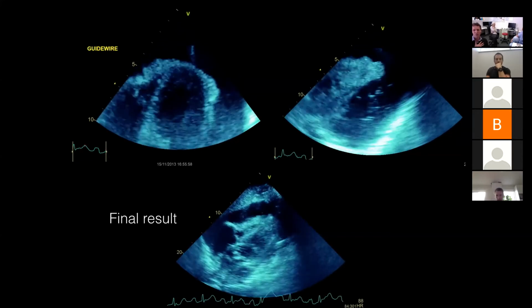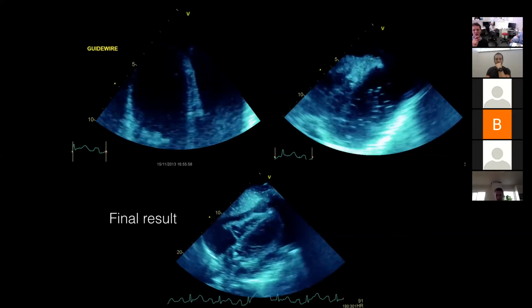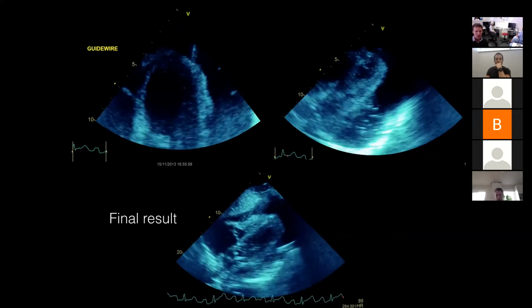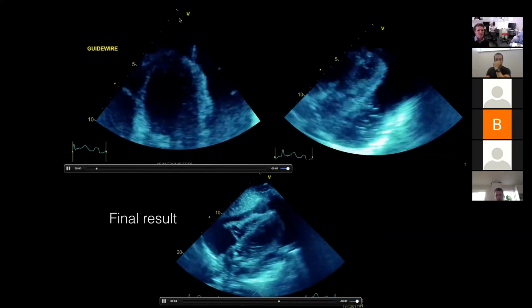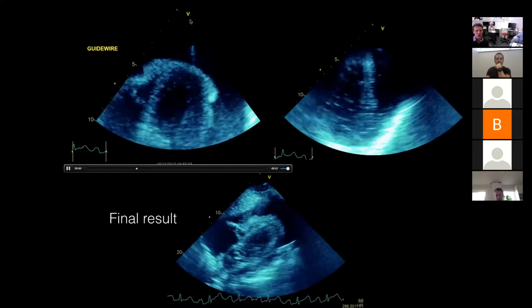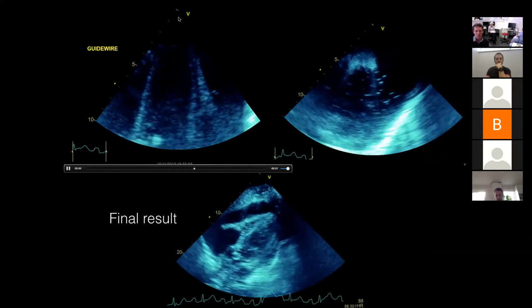I sort of feel a bit more anxious. I prefer it when I've only had to go in 2 or 3 centimeters. So here we can see that the distance I've got to go is 5 centimeters. Here, the distance I've got to go in is like 1 or 2. I feel a bit more confident where I'm putting my needle when it's 1 or 2.